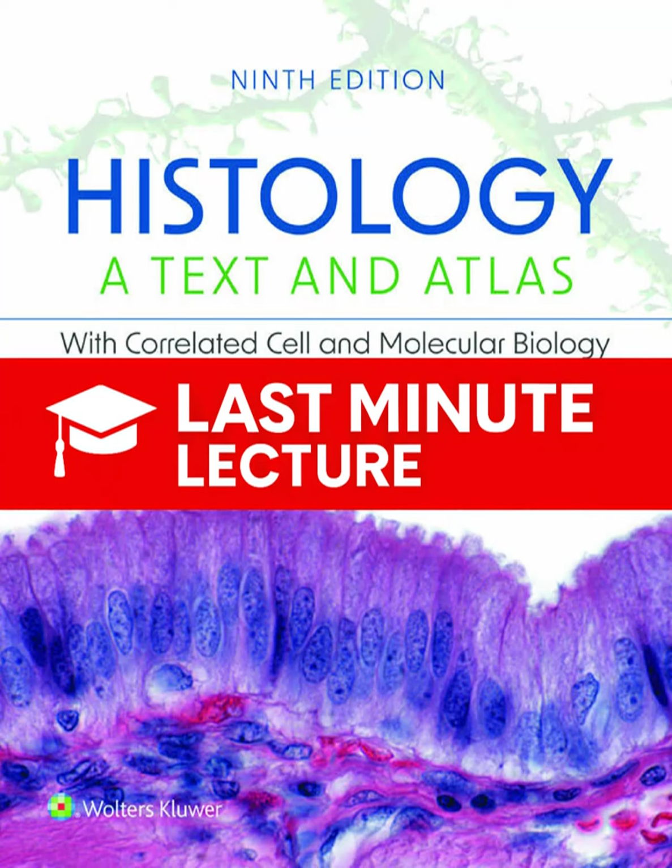Hugely. The sources describe two main ways of doing this quantification. What's the first one? The first is static cytometry. This involves measuring the light absorption in a Feulgen-stained tissue section, like a tumor biopsy, using a microspectrophotometer that's hooked up to imaging software. It precisely measures how much light is absorbed to determine the DNA concentration compared to normal cells on the same slide.